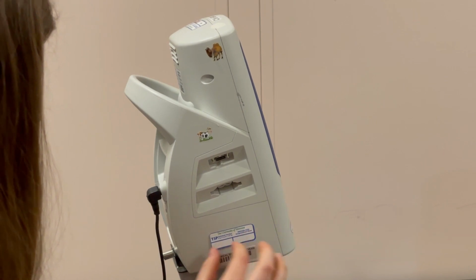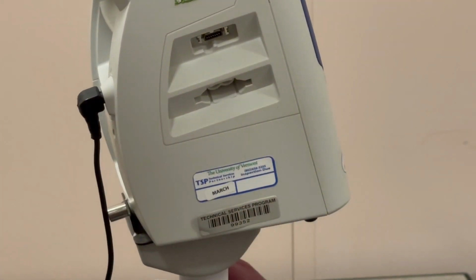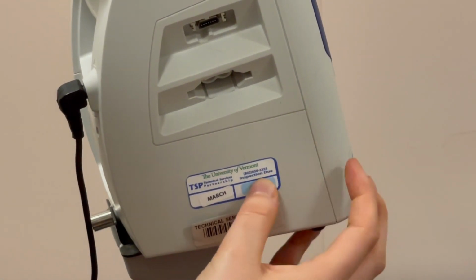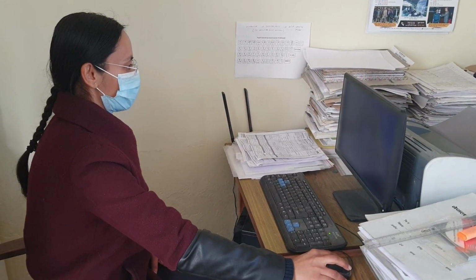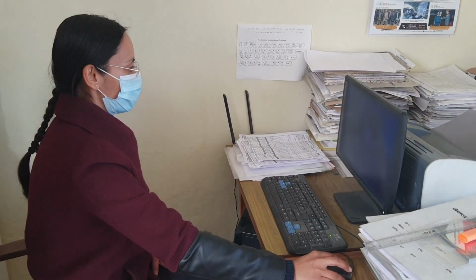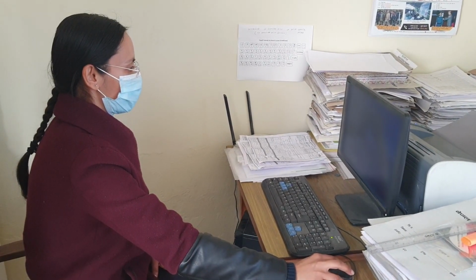If required, apply stickers showing the date of maintenance or date of next maintenance due. Procedures may vary, so be sure to align with your facility. Record the work completed in both the paper checklist and your digital medical equipment database. Ensure that all fields are complete, making sure to note any dates of maintenance and any issues you found.